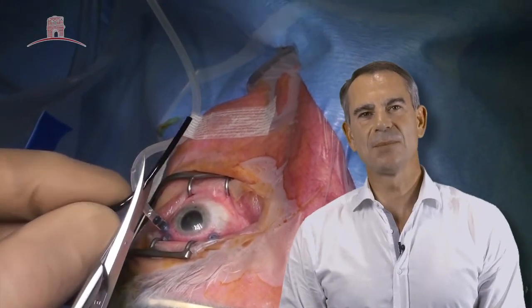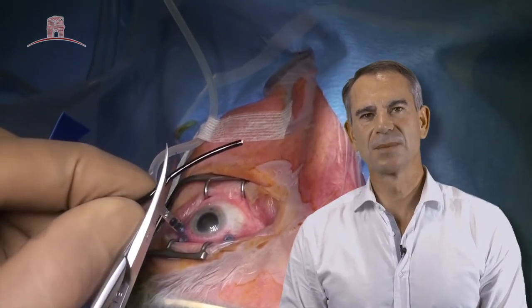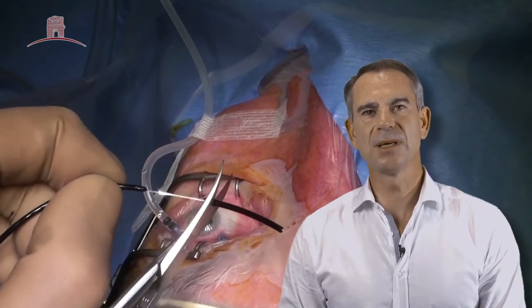Not only does this technique allow for greater visualization and greater access to the retinal periphery, but it is fast, safe, and costless.